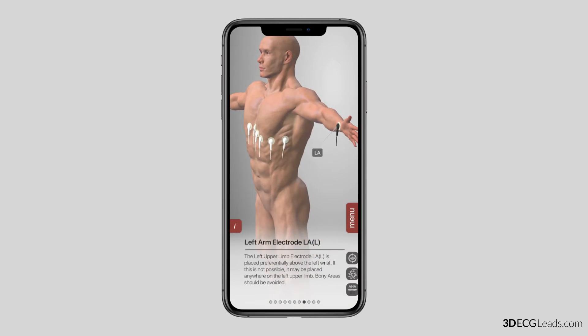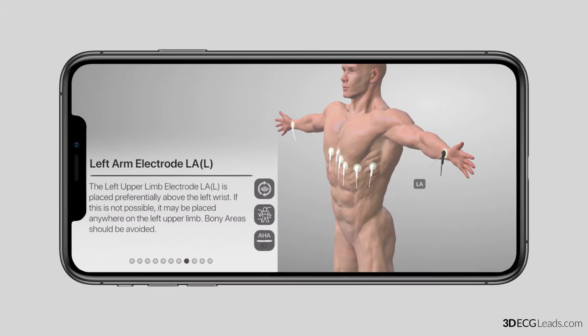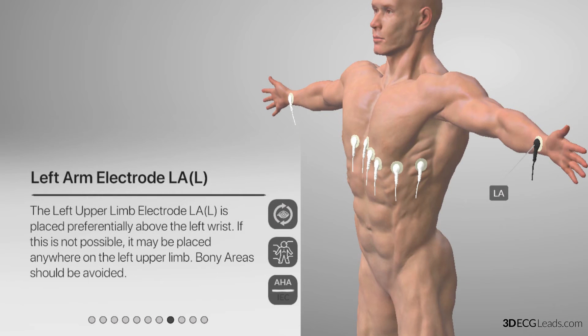The first system that we will look at is the AHA system. As pictured on the model, the left arm lead is named LA, and it should be placed slightly above the left wrist, and is black in color.